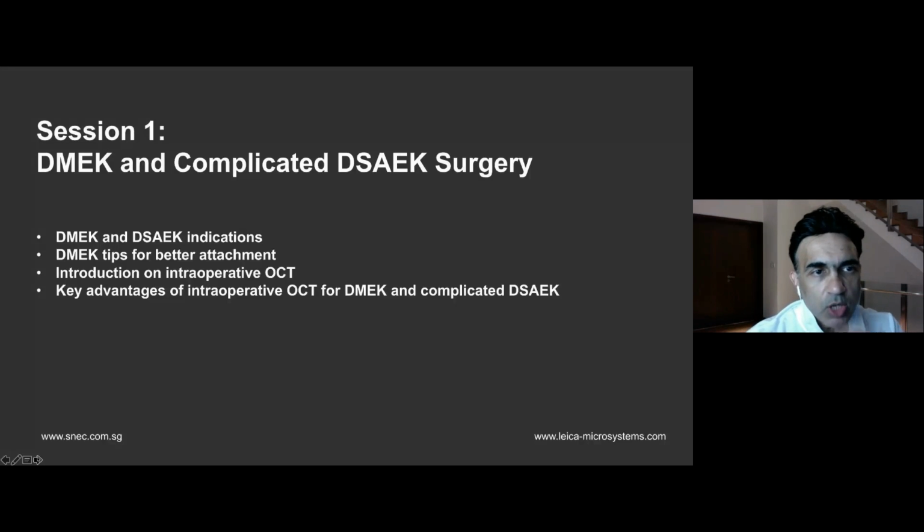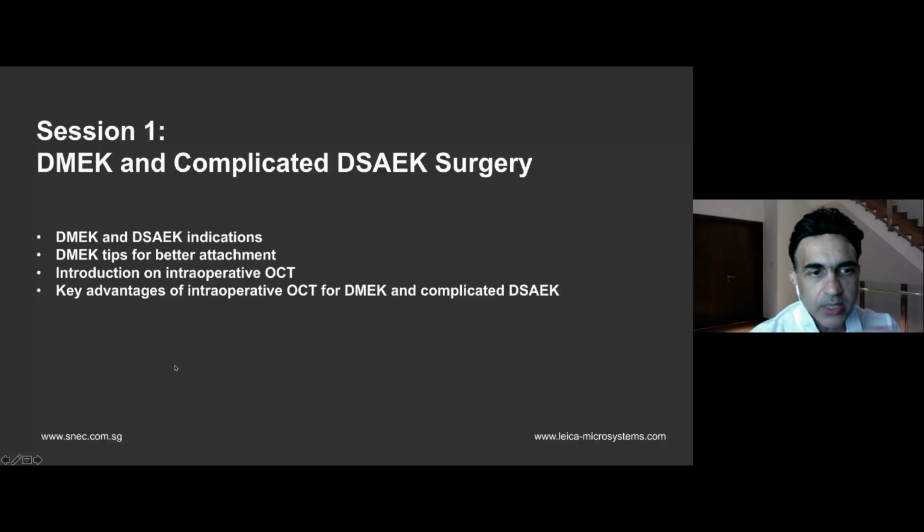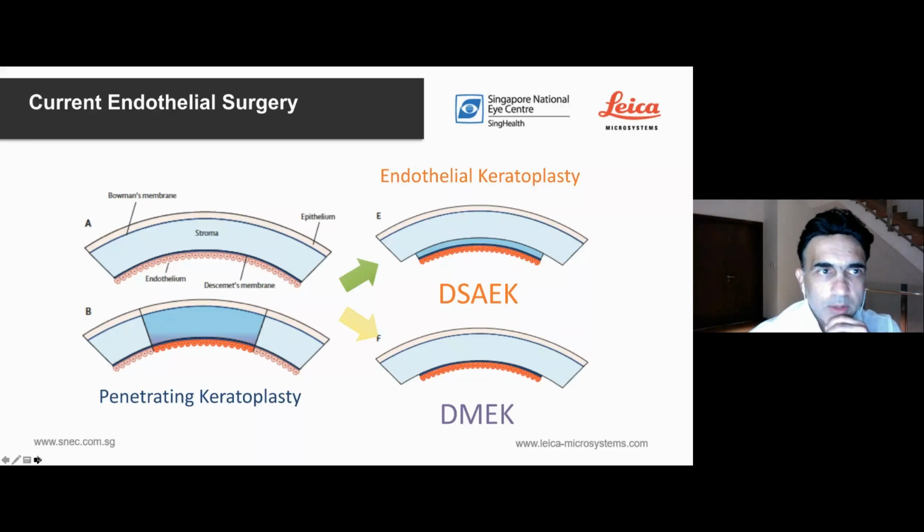I'm just going to give you an overview of this first session. As Phoebe said, this is one of two parts, and today we're really going to focus on EK surgery, primarily DMEK and DSAEK, with some tips for improving your outcomes following the surgery itself. We think that leveraging modern technology such as intraoperative OCT can help with that, and there are some key advantages of intraoperative OCT for these surgical procedures that can help you reduce the learning curve. We'll go through some examples, and I'll talk about this in a little more detail.